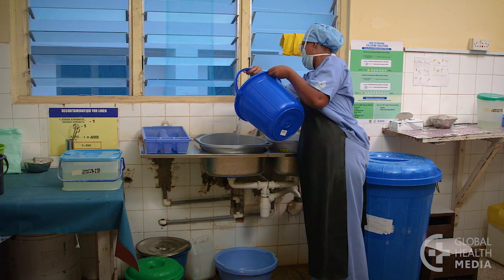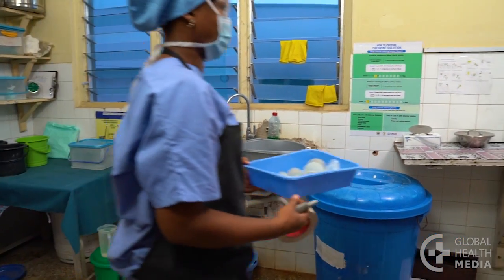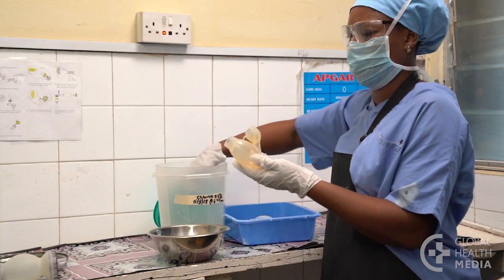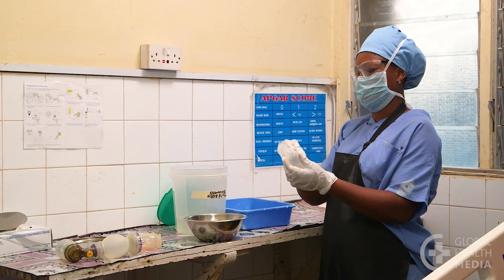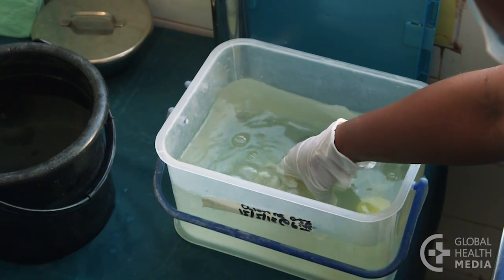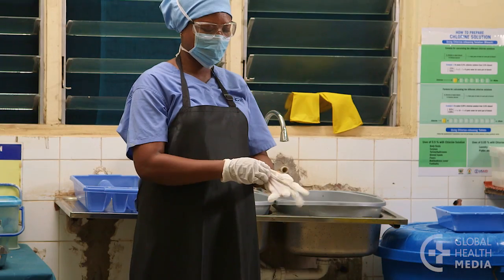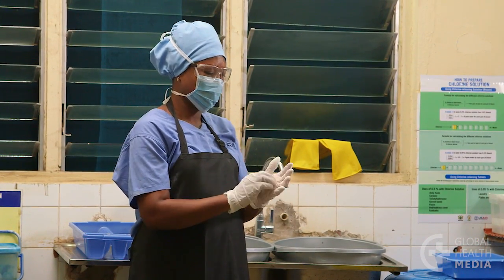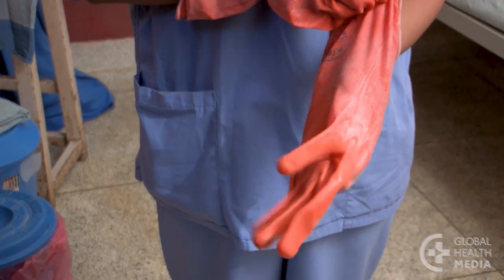The first step is preparation. Organize the room into a separate clean area and a dirty area. Wear protective clothing to protect yourself from harmful germs on the equipment and any splashes of chemical. You'll need boots, an apron, gloves, mask, eye protection and a cap. You can wear clean exam gloves or utility gloves at this step.